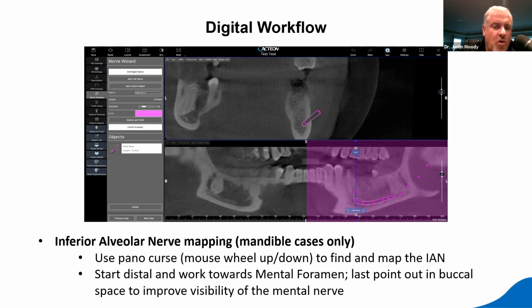now we have the opportunity to scroll through this, that blue line that is bisecting the mandible. We can look at it in cross section in the upper box and see that there's the mental foramen entering the mandible, and we're going to mark that mental foramen and the way the nerve comes in there, so you can see it when it goes in there, because we want to see how that looks in our implant planning software as well.